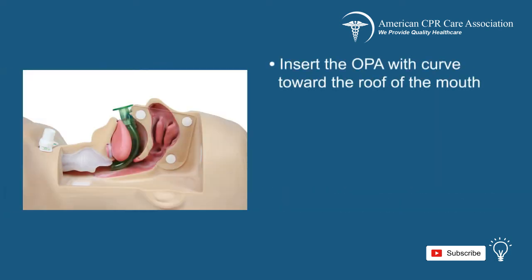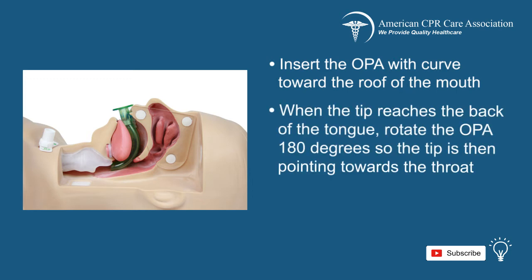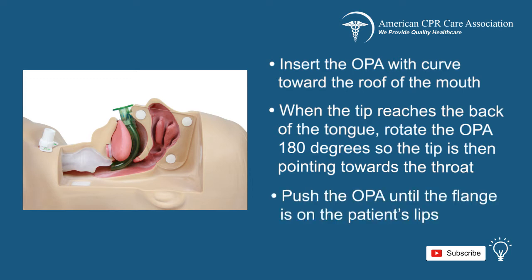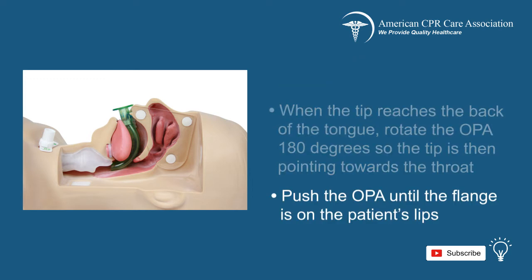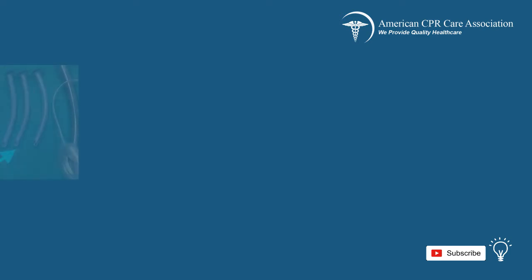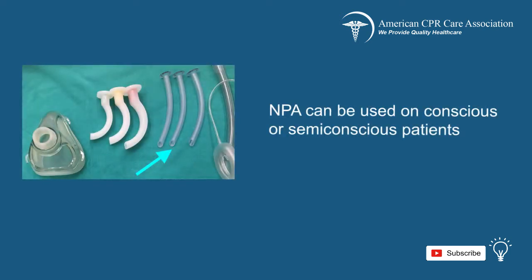Insert the OPA as it curves upward toward the roof of the mouth, being mindful not to push the tongue into the throat. When the tip reaches the back of the tongue, past the soft palate, rotate the OPA 180 degrees so that the tip is then pointing toward the throat. Push the OPA slowly until the flange is resting on the patient's lips.